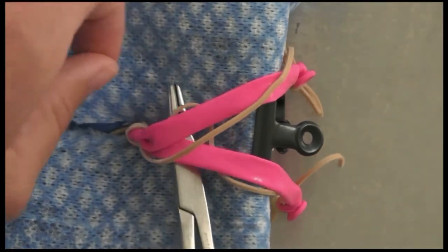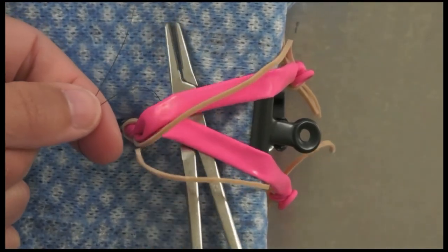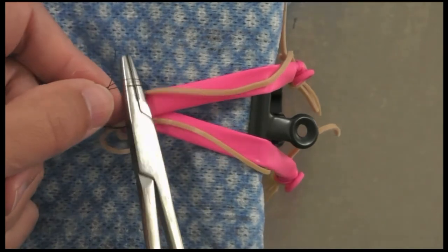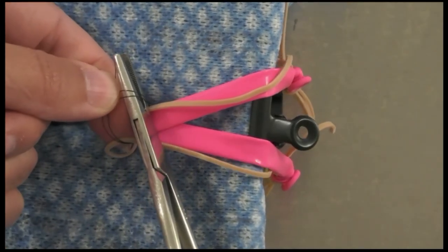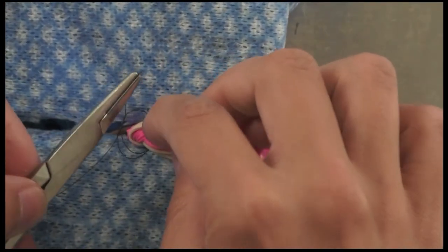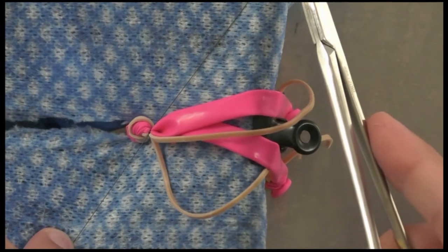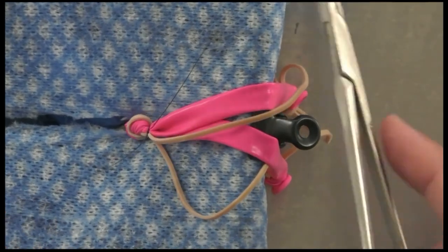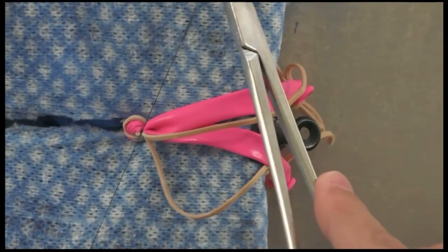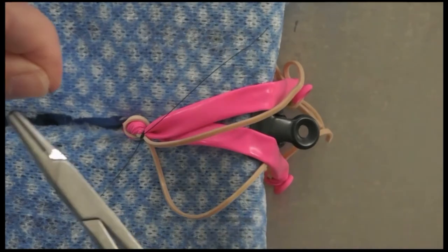I'm using a strangle knot: go under, make an X on your finger, hold it with your thumb, do the same again, go under the two loops, grasp the end, check it looks correct, move it to where you want it, then strangulate that tissue down — applying good pressure to crush all the tissues and any vasculature. I really like the strangle knot for any uterus; it's a beefy knot that makes you feel secure in your ligature.